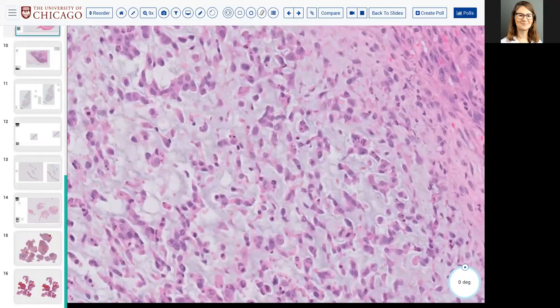So any myoepithelial tumor is going to have to be positive for keratin or EMA, one of the two, plus some other evidence of myoepithelial differentiation, whether that be something like an S100 or, as Fletcher, you read about, GFAP, or what you expect to see in a salivary gland site, like an SMA, a calponin, a P63 or P40, or for that matter, a high molecular weight keratin.